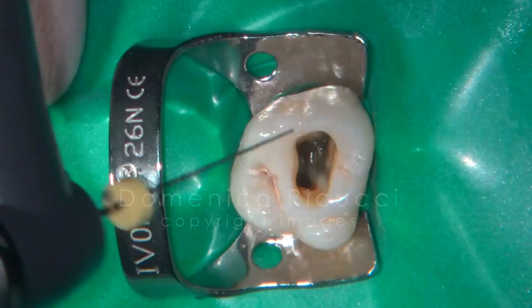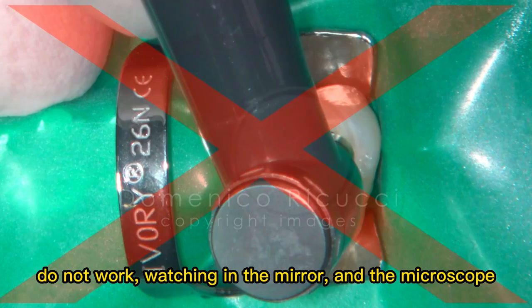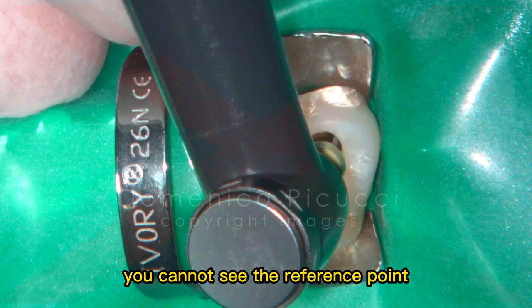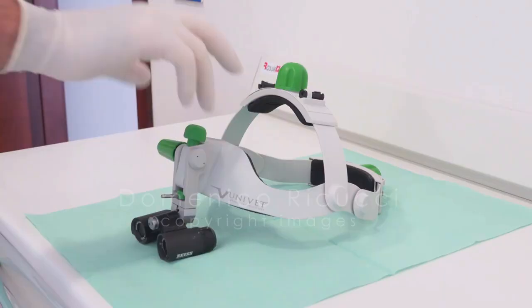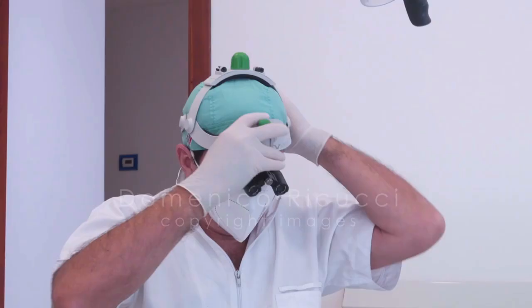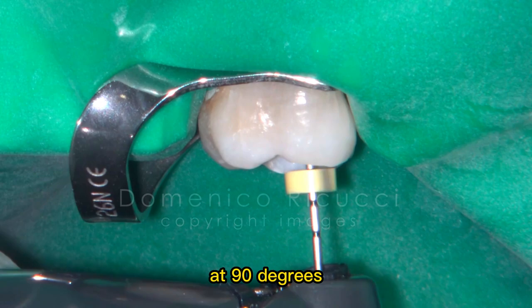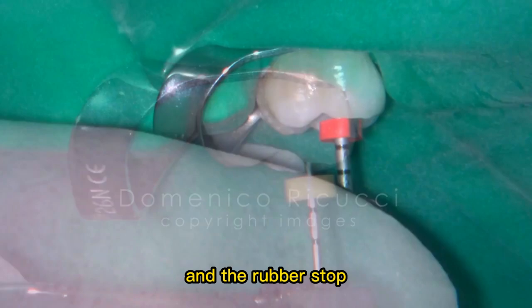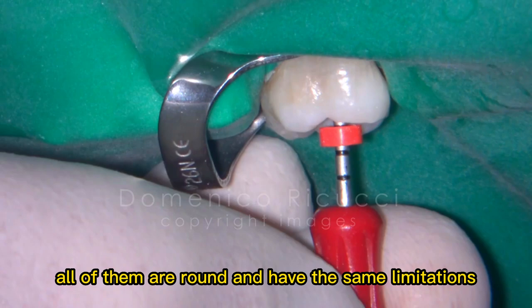Do not work watching in the mirror and the microscope while introducing rotary instruments in the canals — you cannot see the reference point. The microscope is no longer necessary at this point. Use another magnifying device and position yourself in a way that you can clearly see at 90 degrees the relationship between the reference point and the rubber stop. I have no preference for any nickel titanium instrument. All of them are round and have the same limitations. The following is just an example of protocol.